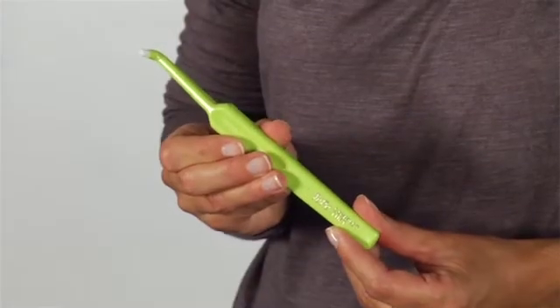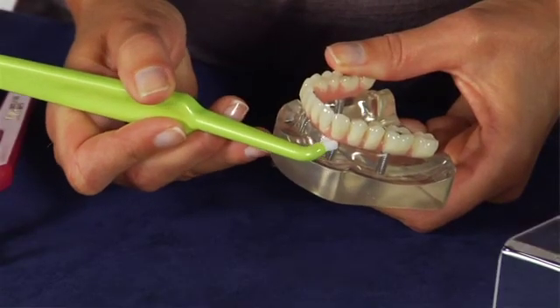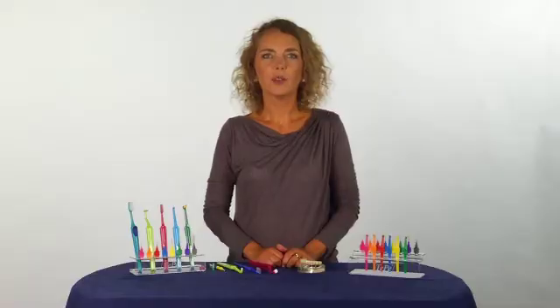If you have a certain area that needs special attention, this compact dome-shaped brush will be of great help. Remember, good oral hygiene is critical for the long-term success of your implants.